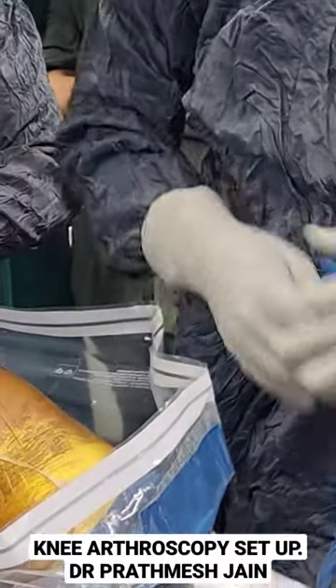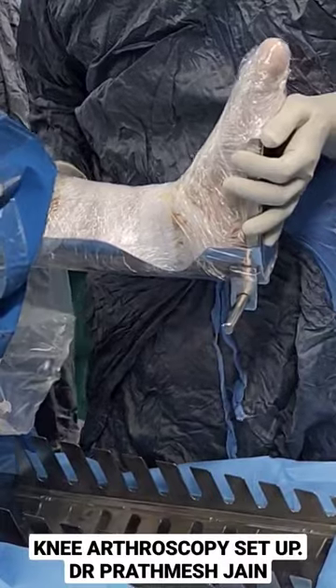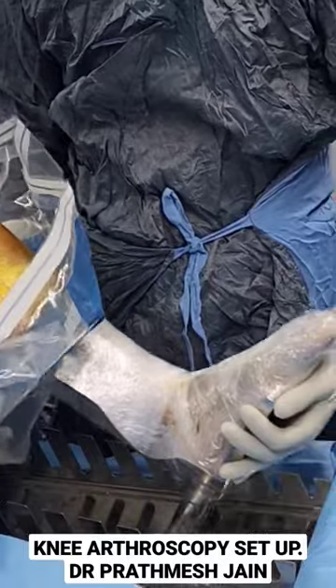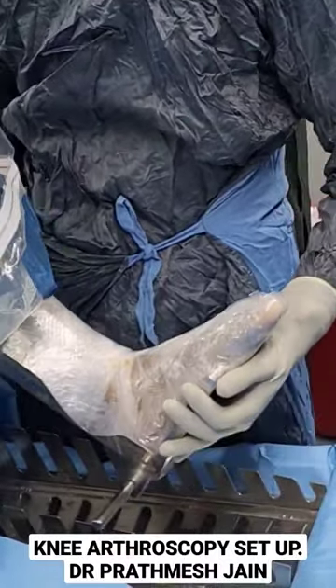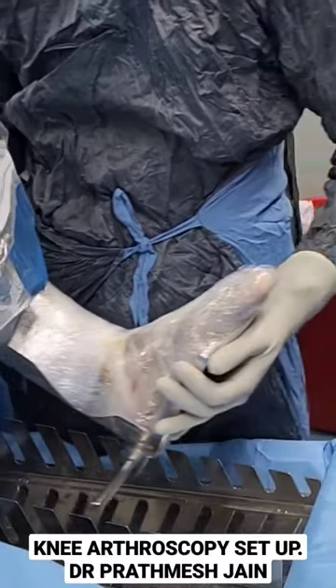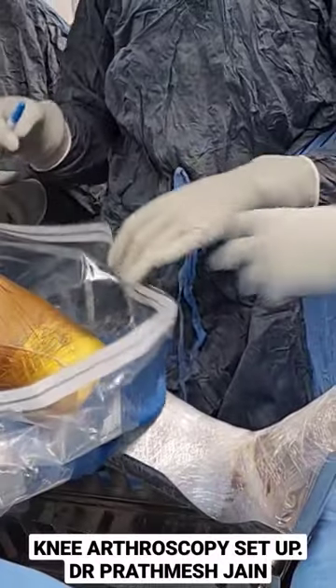Besides that, we are using this sort of a stand to achieve our positioning. This stand has an advantage in that it has different levels, so we can adjust the flexion of the knee. You can extend or adjust your extension and flexion while doing any of the surgeries.